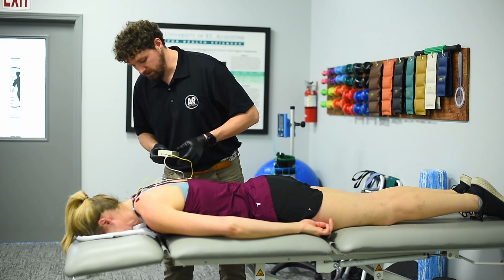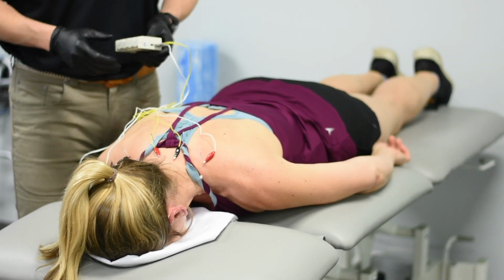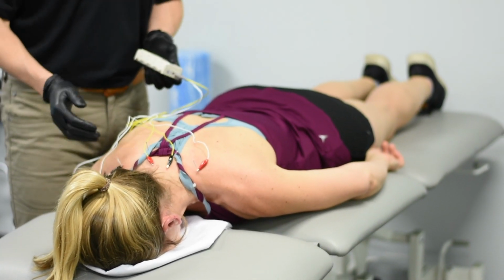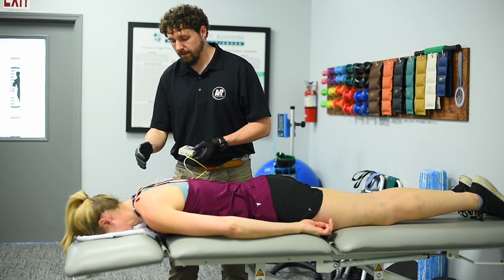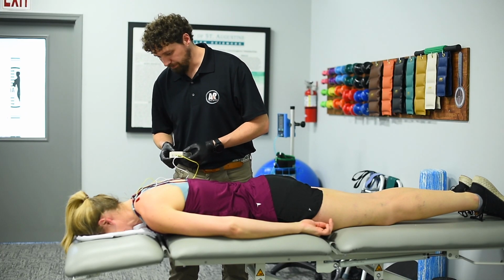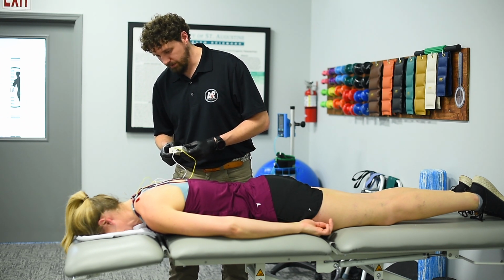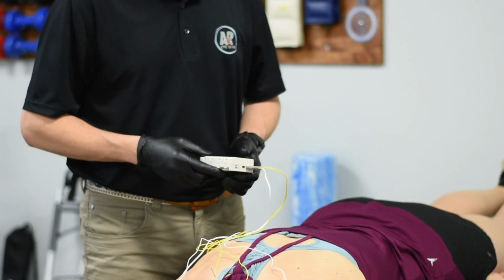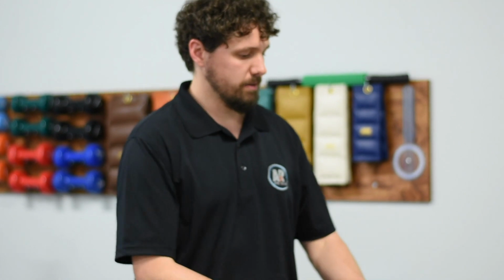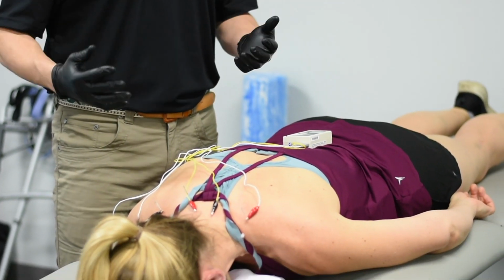Just let me know when you start to feel a little bump. It's okay there? Not too strong? No. All right, now you can see those muscles moving, jumping a little bit, helping to loosen them up more. So we've got those. Now we'll move up into the other two. Let me know if you start to feel the other two. Yes. Once we get it comfortable there, this might be one that I'll let hang out for maybe 5, 10, 15 minutes, depending on what's going on. We let those muscles contract and release and loosen up.